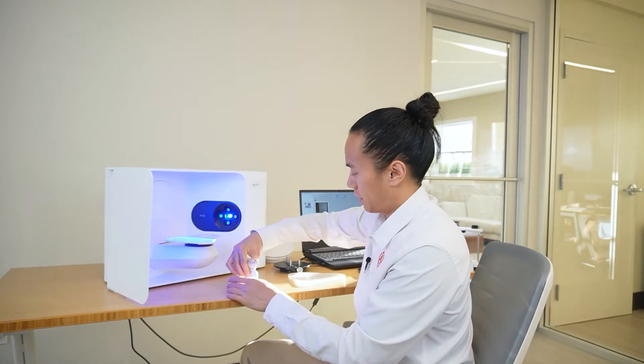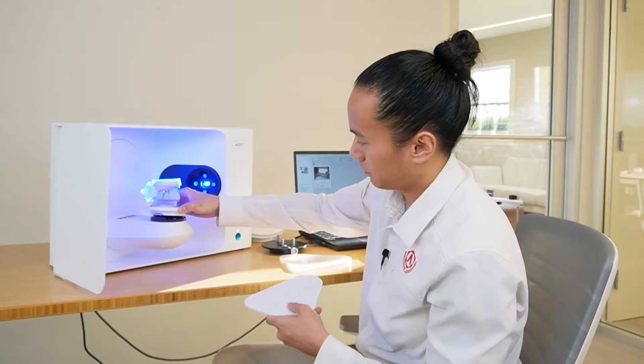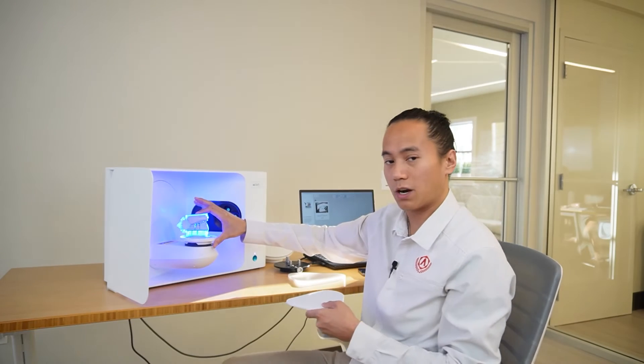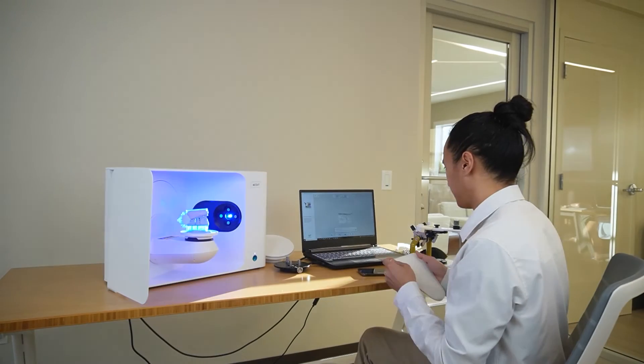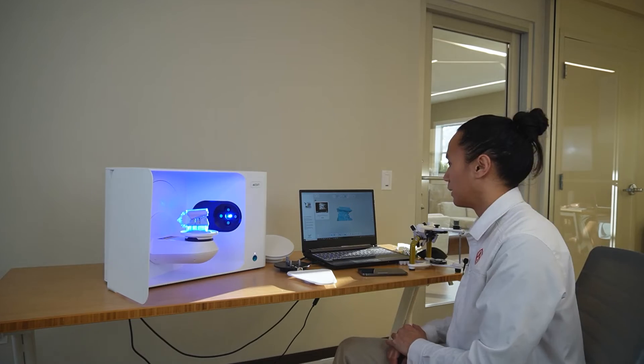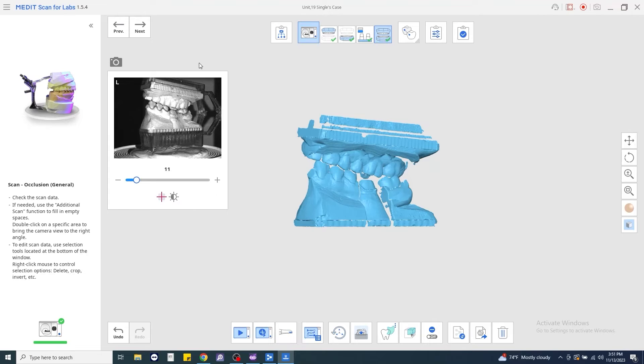We'll place our models on our plate. Make sure everything is stable. Don't forget to double check your brightness and then click scan. Once everything looks good, we'll go ahead and click next.